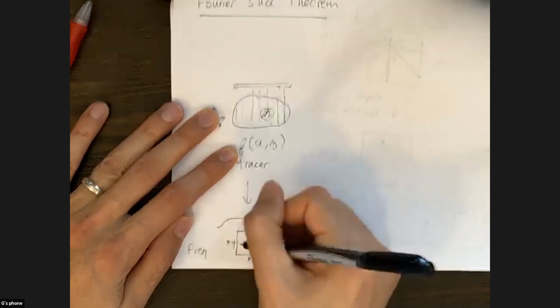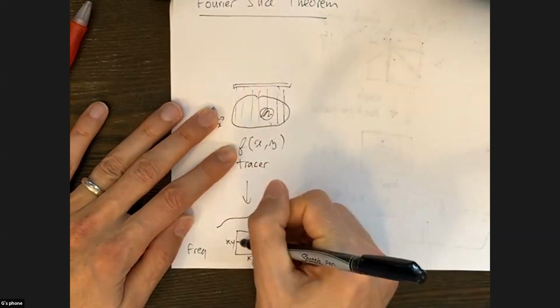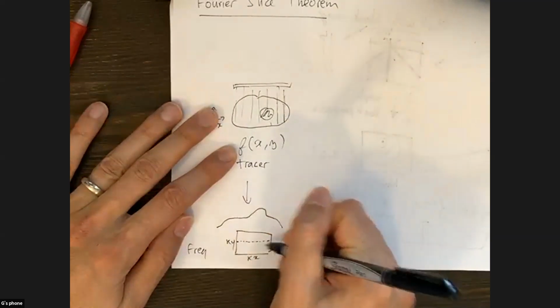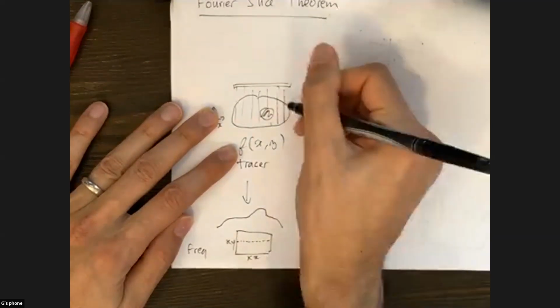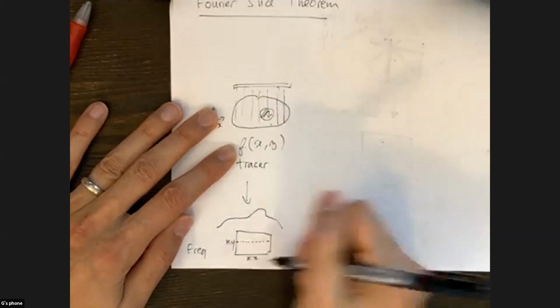So we're measuring all the horizontal frequencies because they're preserved, but we're losing the vertical frequencies, and all we're measuring is the DC term for the vertical frequency. So by averaging out the image, we're measuring the average signal, which is the DC term, right? The zero frequency essentially is the average of the signal.